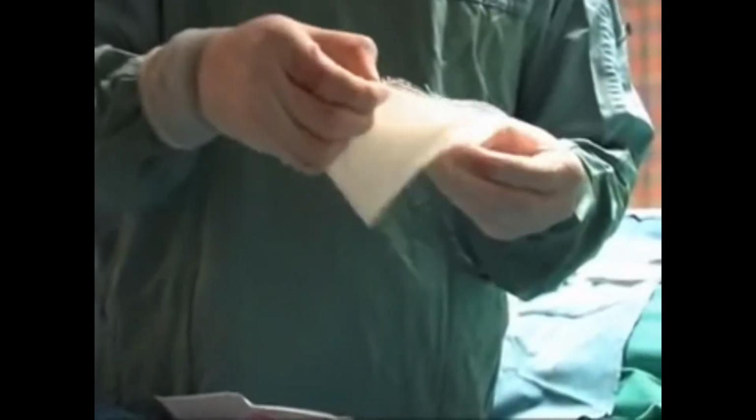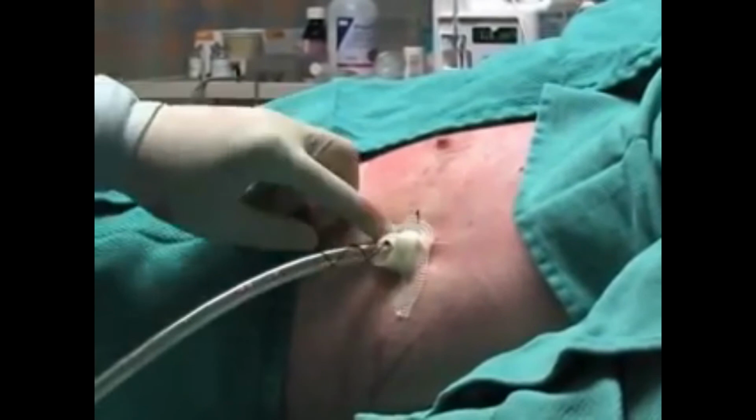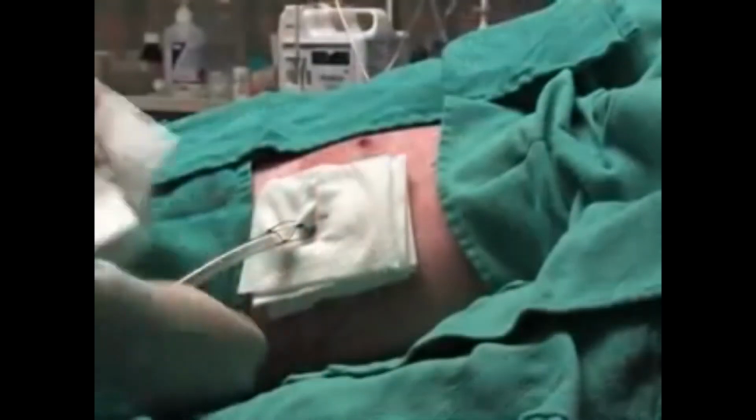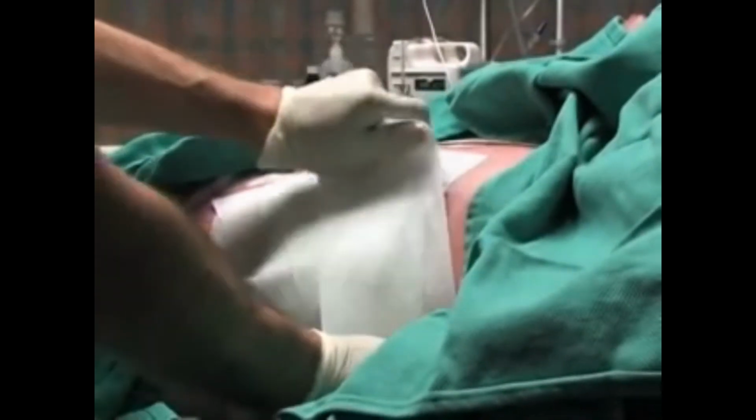Once the chest tube has been secured, a petroleum-based gauze dressing should be wound around it. Then apply several pieces of sterile gauze around the tube and secure the site with a pressure dressing.